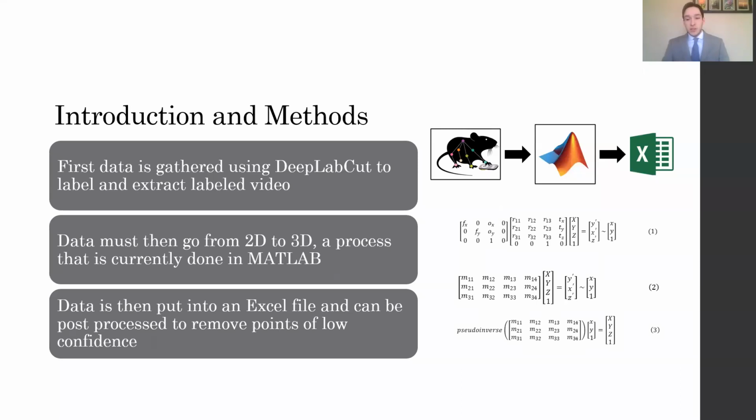All right, so to start with, the origin of this paper really resides in a desire to better quantify postural instability, which is an important risk factor in a variety of disorders, notably Parkinson's. The current standard for determining how bad a patient's postural instability is the retropulsion test, in which a clinician pulls on the shoulder of a patient and then observes their response to that stimulus. There remains an issue, however, on how to standardize this test. For example, is the clinician pulling with the same force every time? Particularly, how do you determine what's a good or bad score?